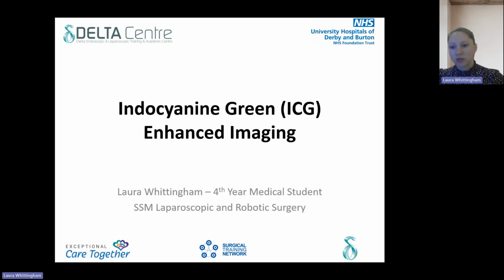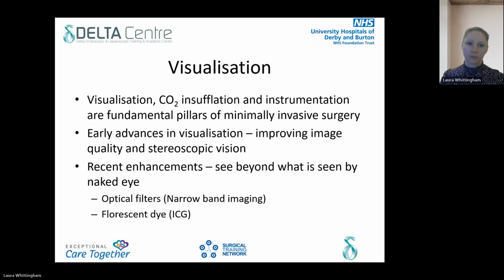This is a short presentation on indocyanine green enhanced imaging. A quick recap on visualization: it's a key aspect of minimally invasive surgery. It's one of the three core pillars along with CO2 insufflation and instrumentation.